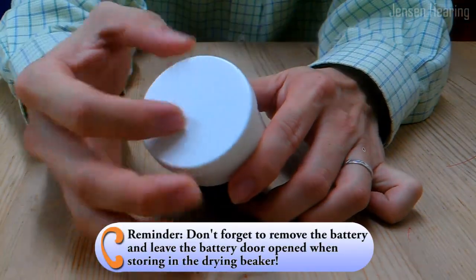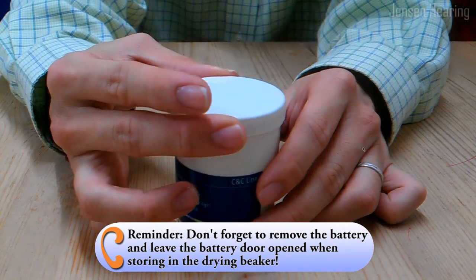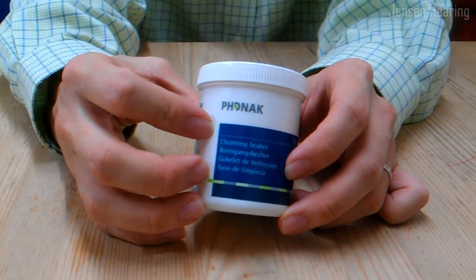Then make sure you screw down the lid tightly to ensure it's airtight, so there will be effective drying of the hearing aid through the night.